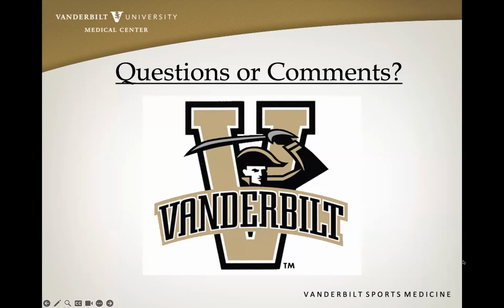Yeah, I think the side to side as well is key, especially if you don't do a ton of these, and obviously with variability between patients, the side to side I think is key with this one. Yeah, no, 100%. This is definitely one of the first cases that I saw as far as the dorsal scapholunate, and it made it so obvious. If you do have an asymptomatic side, that's just another benefit of the ultrasound, is that you can just do a quick contralateral comparison.